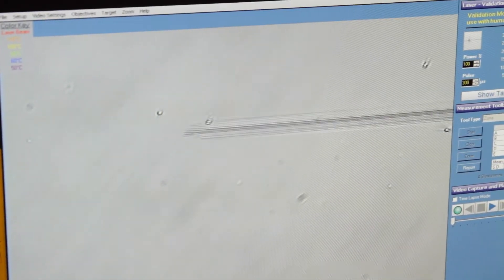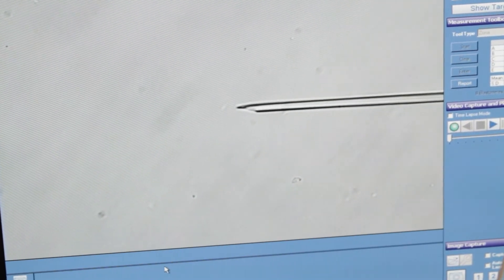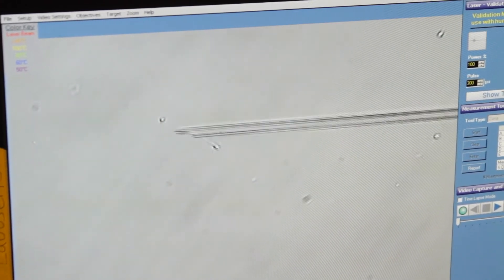It serves two purposes, so it slows the sperm down so that we can catch them. It also makes it easier to control that fluid because it's a viscous fluid, so we're using suction to control the injection.